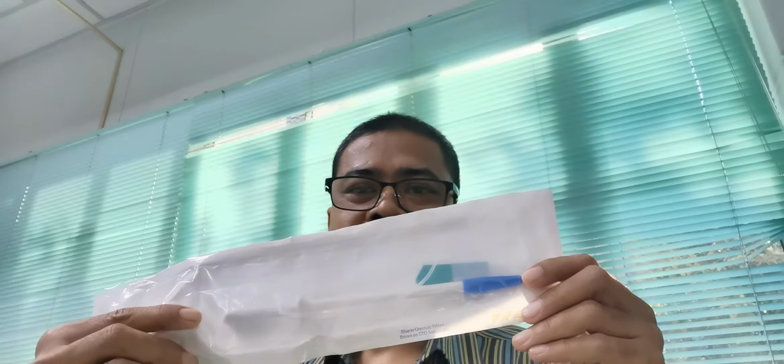One is catheterization, and another one is suprapubic catheterization or Cystofix. Okay, it looks very simple, but it is not uncommon that you receive a referral from other departments with problems with catheterization: unable to change the CBD, the catheter stuck, patient develops hematuria after the catheterization.